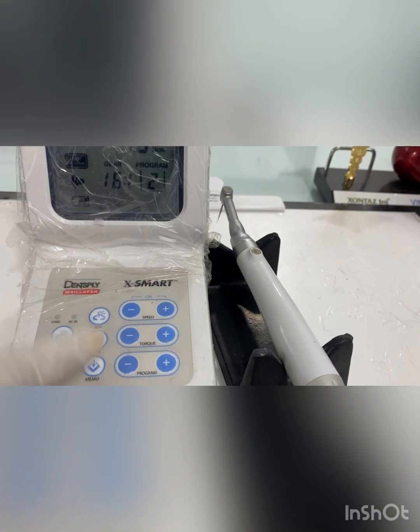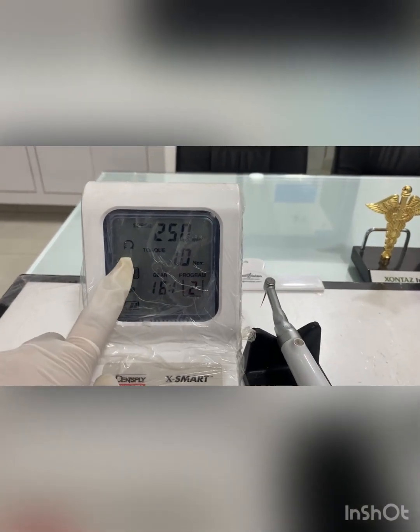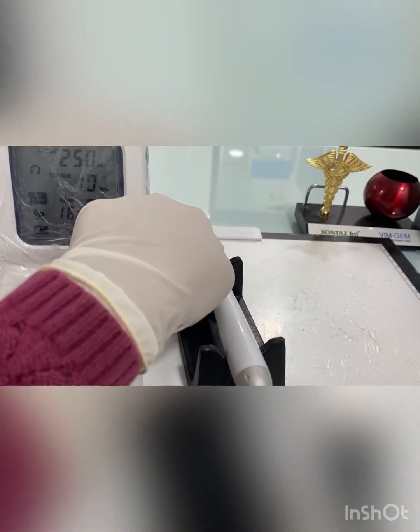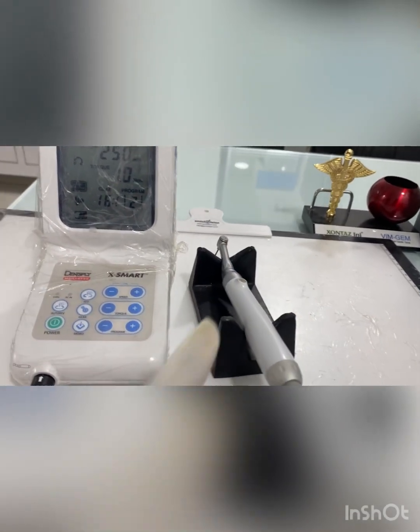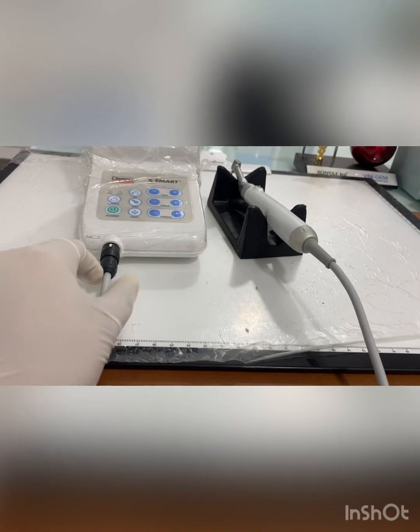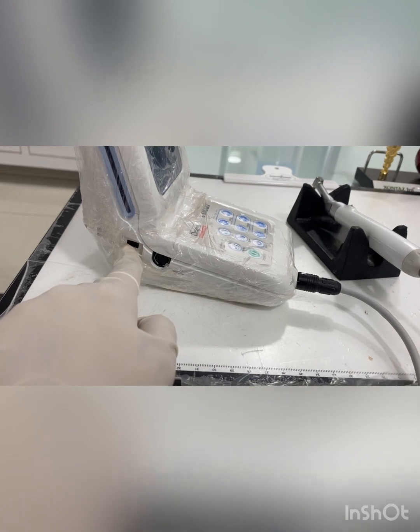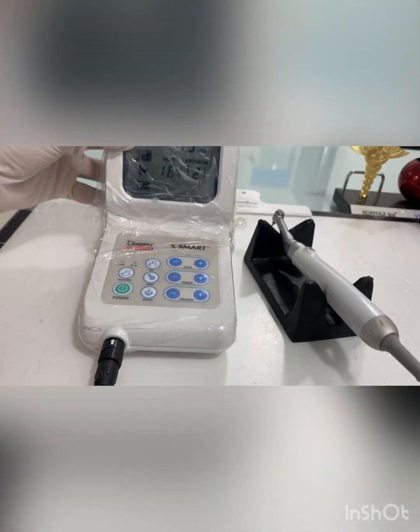You can see the control unit, the operational panel, and the LCD panel. This is your handpiece, this is your contra angle, and this is your file. The handpiece is connected at this point. There is also a foot pedal connector and an AC charging adapter connector.